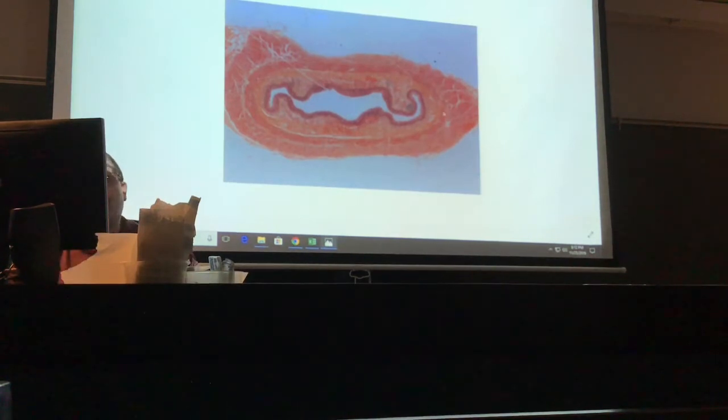The first place that we're going to look at along the digestive tract is a tube called the esophagus. And the esophagus connects the oral cavity with the stomach. Some unique features to it. This is just a really low magnification look at the esophagus. You can see kind of the different layers, the submucosa, mucosa, the muscularis here.